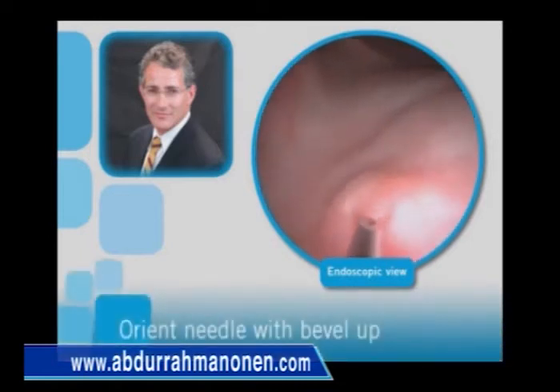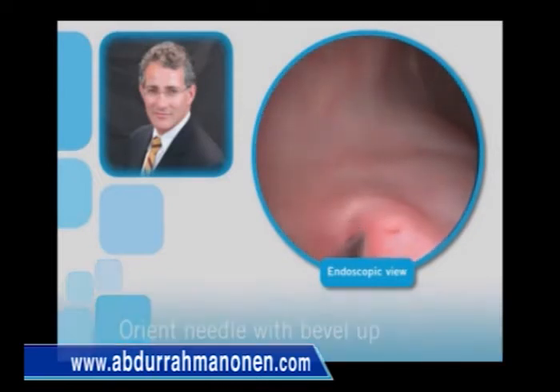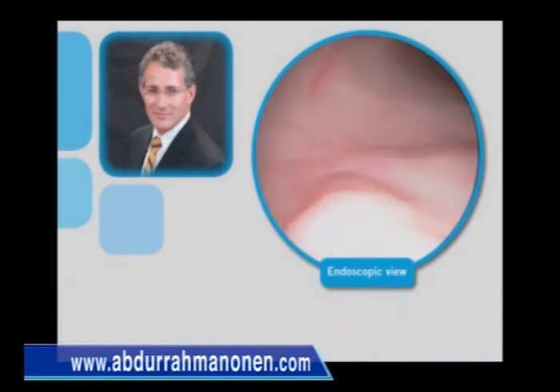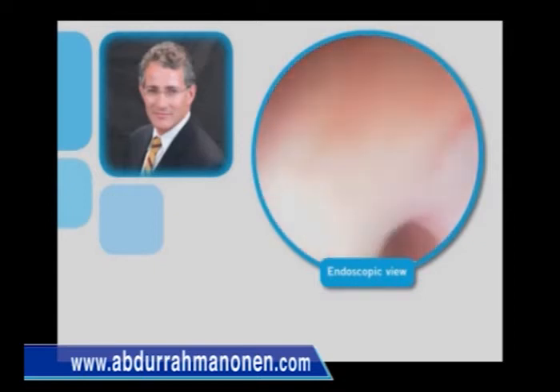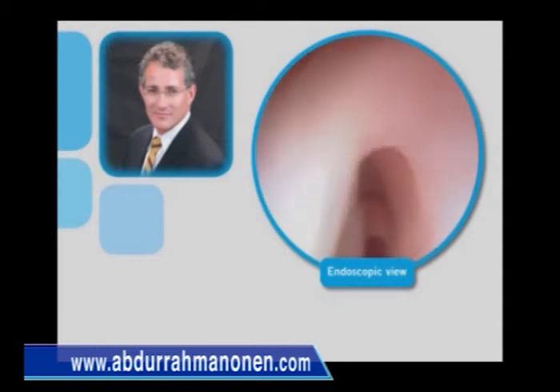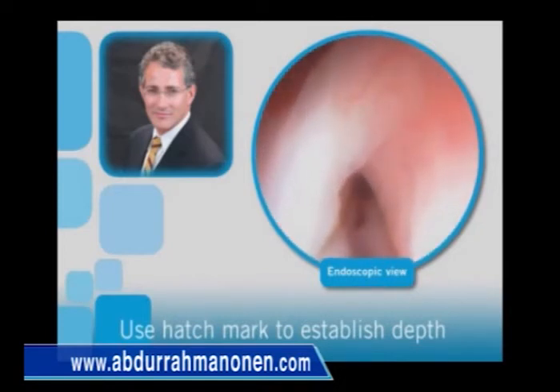The needle for injection is passed into the lower pole ureter under direct visualization. When the ureteral orifice is not noted to hydrodistend easily, the needle may be placed in similar to placement of a ureteral catheter, and hydrodistension will then be performed once the tip of the cystoscope is placed in the orifice, as shown here. With this technique, the proper depth of injection may be seen by placing the needle to the point of the hash mark on the needle.